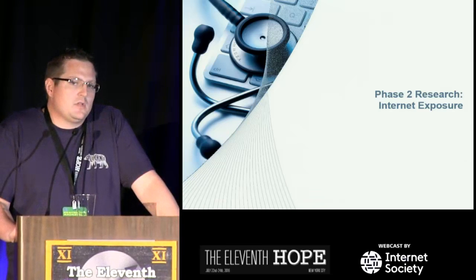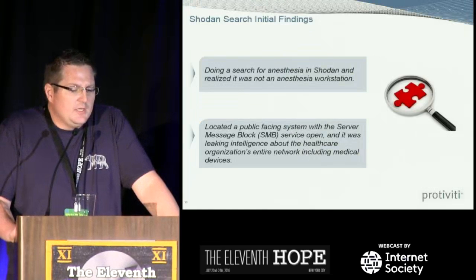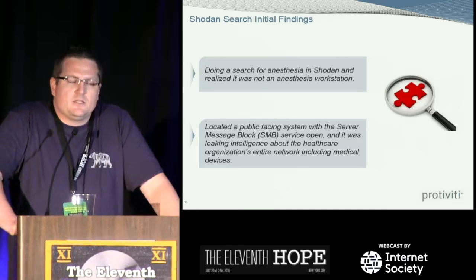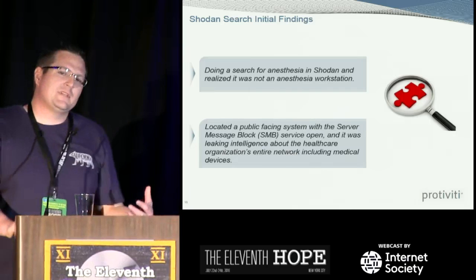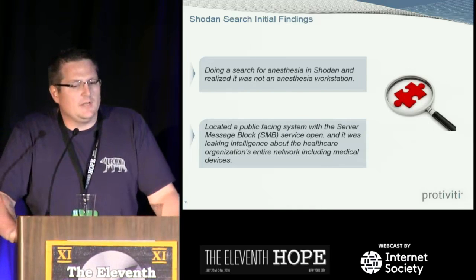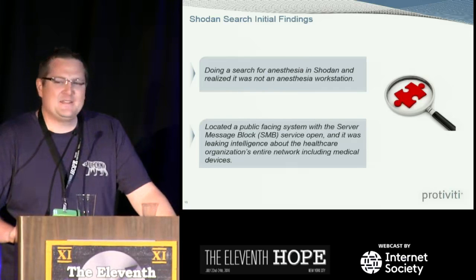So I worked with another researcher, Sean Merdinger, and we ended up looking into Shodan. At first we were doing super elite hacker searches that you'd never think of for medical terms. The one I came up with that was super awesome was "anesthesia," that no one would think of. When we did that, I got a return, and I said, let me look at this system. I've been doing this a while, and this clearly isn't a medical device. The only indication that it could have been a medical device is that it was an XP system.